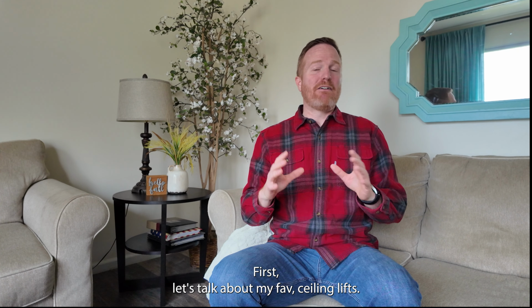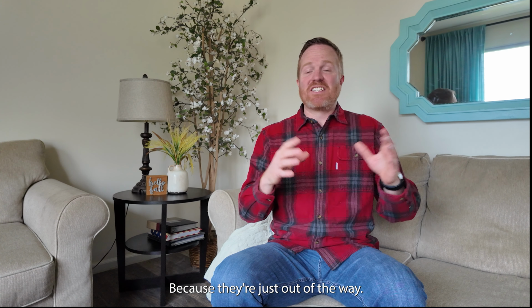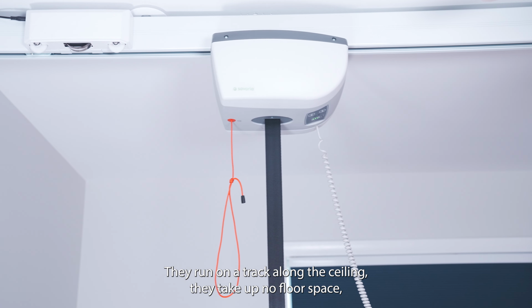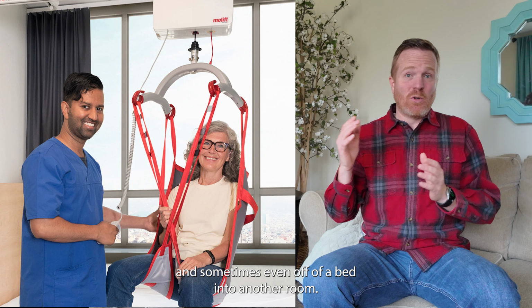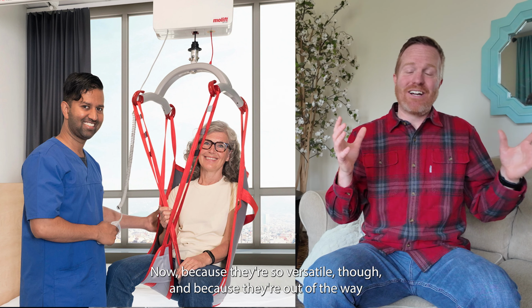First, let's talk about my fave, ceiling lifts. And why is it my favorite? Because they're just out of the way. They run on a track along the ceiling, they take up no floor space, and they're very, very practical for moving a patient off of a bed into a wheelchair or a mobility device, and sometimes even off of a bed into another room.